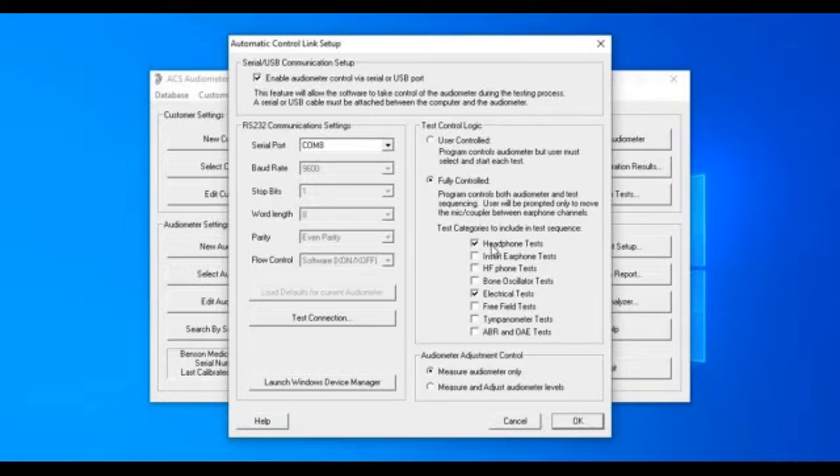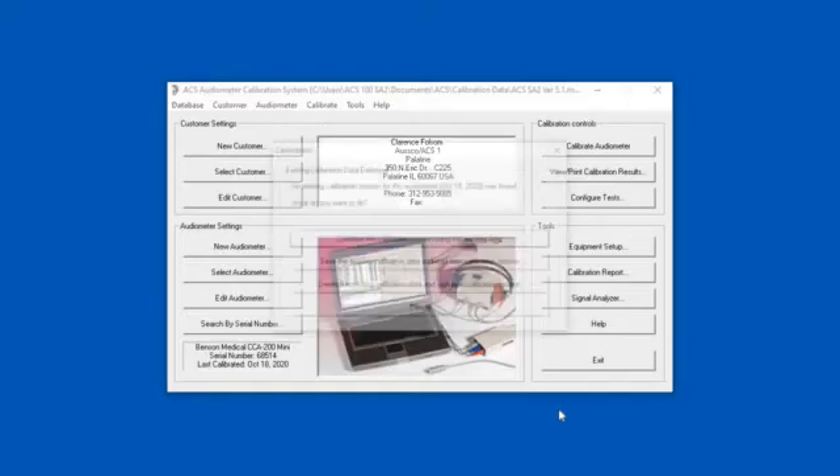The system knows that the only thing it's going to do is calibrate headphones. It's not going to do inserts, high frequency, or bone — but it is going to do the electrical test, because the ACS system analyzes everything about that audiometer. We have the option to just measure only and change nothing, or to measure and adjust, which is 99% of the time what you're going to be doing, unless you're using it as a daily biological calibrator or just checking whether your audiometer is in calibration. We're ready to calibrate and start the test.